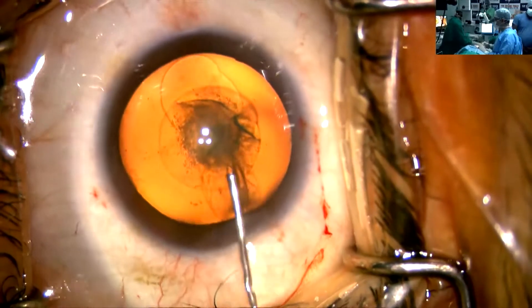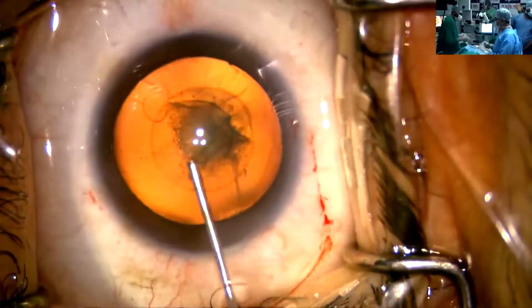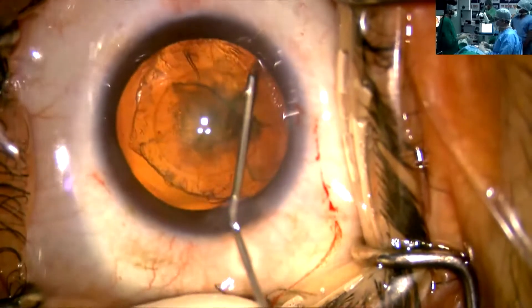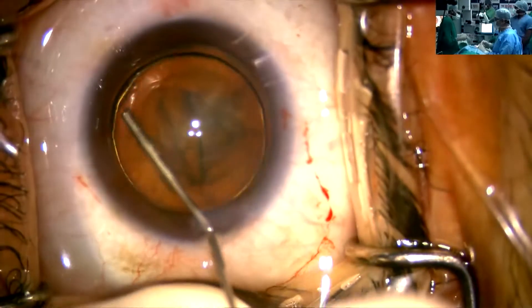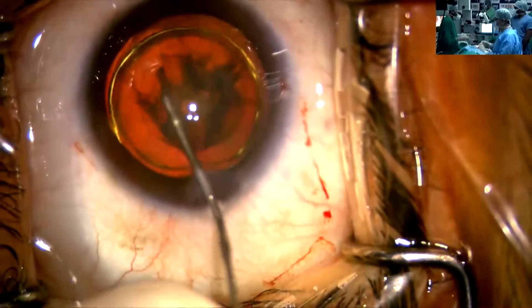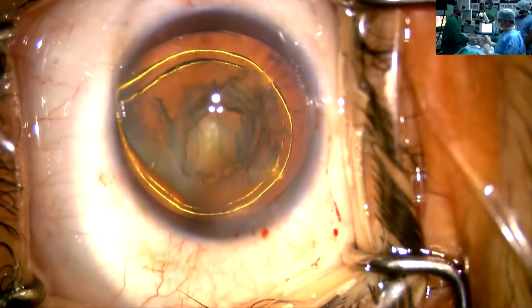Now I will be doing the hydro — gentle hydro with a 2 cc syringe. This is a step to be careful about. Never use too much pressure, and always compress in the center after starting the initial hydro, then from the other side. You can see the beautiful golden ring. As this is a soft cataract, there is not very much in the cataract.